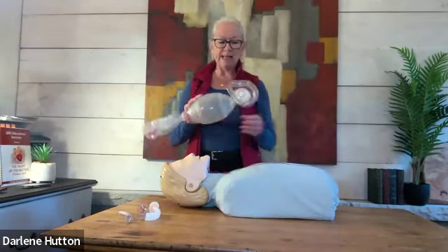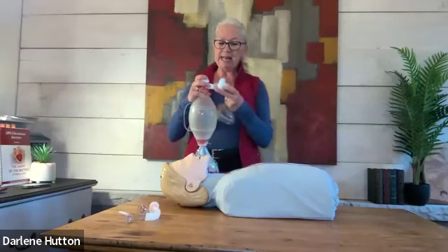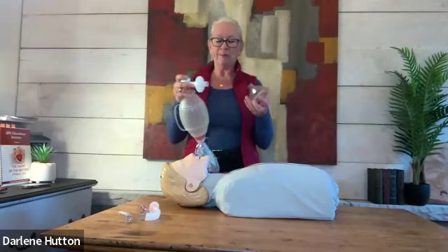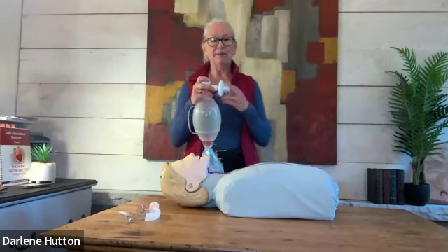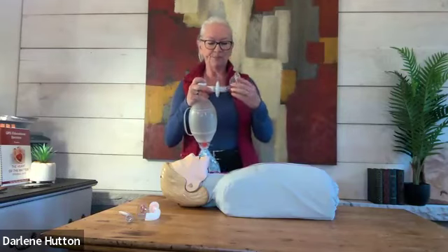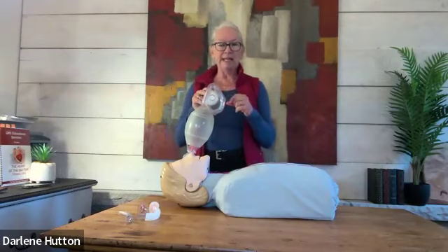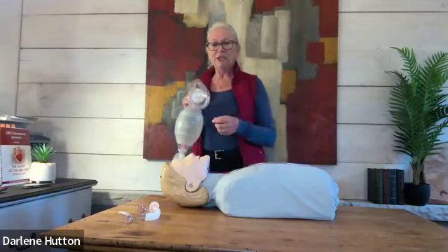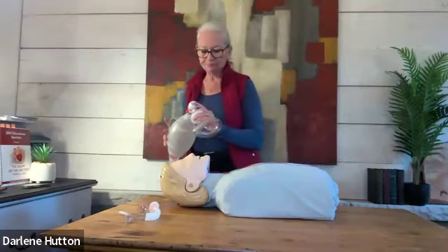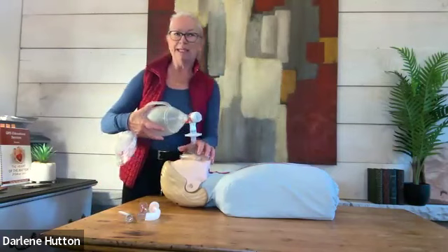You're going to get the Ambu bag, and you will need to possibly put everything together. The nice thing about how this equipment has all been designed is you can't connect it improperly. You always want to ensure that you do have a filter, and a lot of the newer bag valve masks do have built-in filters. The other thing to be mindful of is how to place the mask. I've seen some people getting confused. Just a quick tip, the narrow part is going to go to the nose.